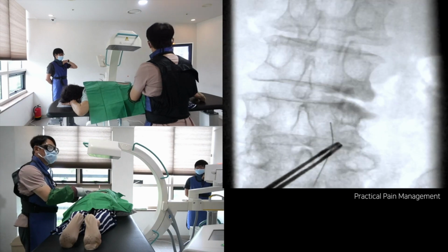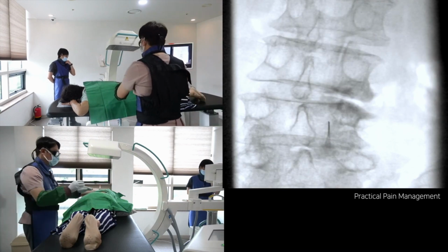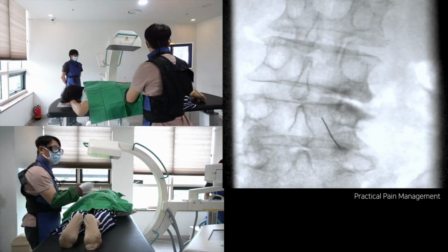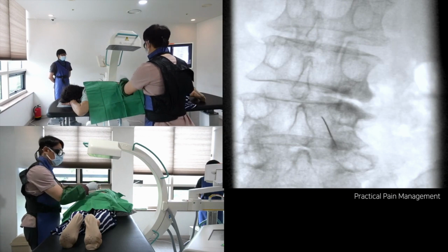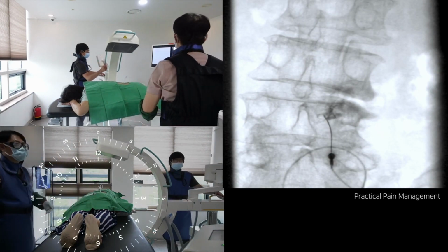I prefer the inferior recess approach to the facet joint as it has certain advantages over the superior recess approach. To successfully access the inferior recess, you need to focus on the inferior margin of the L3's inferior articular process over the L4 body. It may appear easy, but it can be challenging for beginners, so proper practice and observation of the inferior recess is recommended.